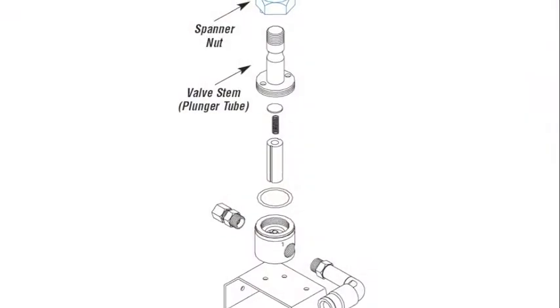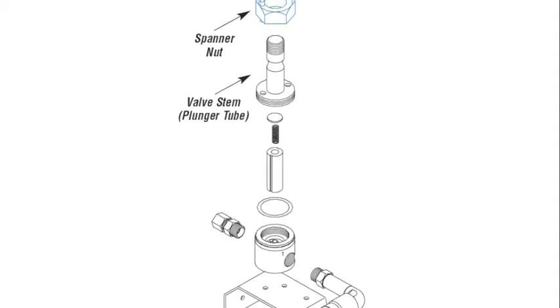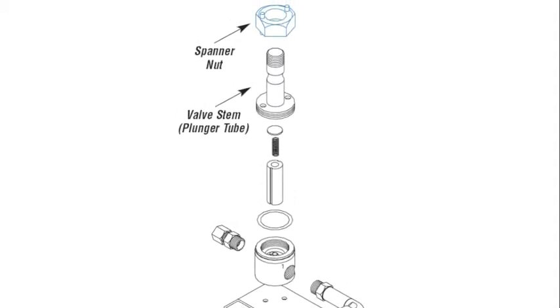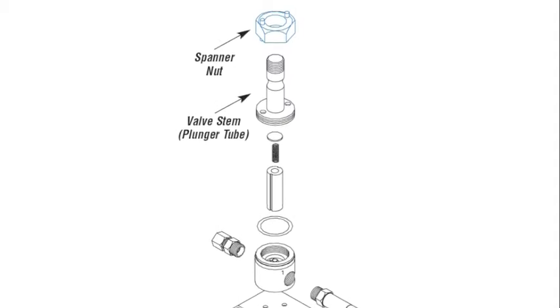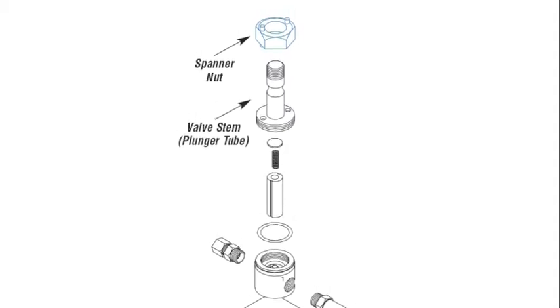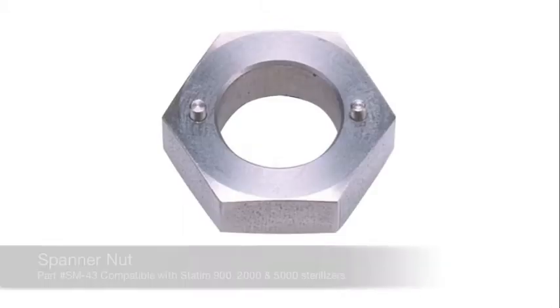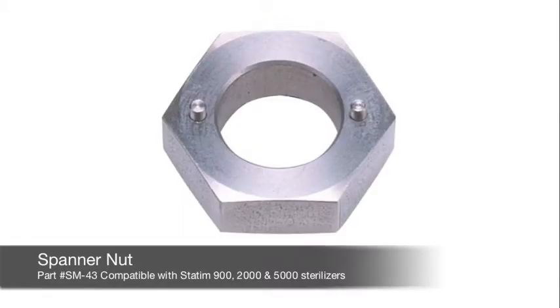The manufacturer suggests using a pair of pliers on the welded area of the valve stem or plunger tube when removing the solenoid valve stem. If this is done incorrectly, the pliers could collapse the hollow area of the valve stem, preventing the plunger from moving freely. We offer a spanner nut which provides an easier, safer way to remove and install the valve stem. By using the spanner nut with a wrench, the valve can be removed without disturbing the plunger.